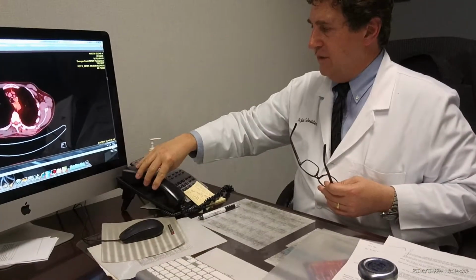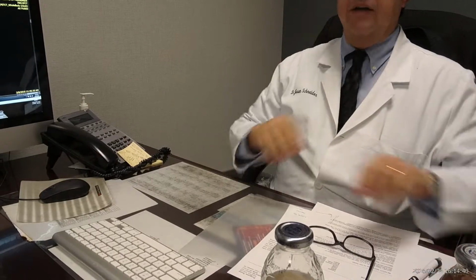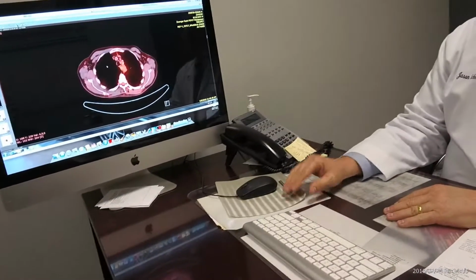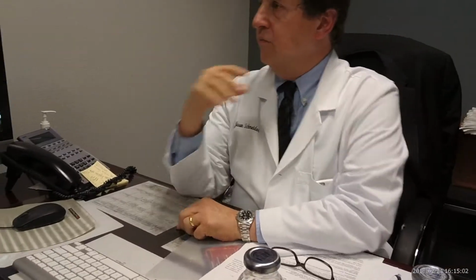Oh, thank you. If I may, after the information that we saw with you before, as you know, we asked you to have this scan done because the areas of the body can have different things going on. This PET scan, which is a CAT scan along with the functionality scan, gives us a clinical indication whether there is potential for something unfortunate to be infection, inflammation, or possibly a cancer. CAT scan or PET scans will light up in any of these three places, but what you have to do when you see these is correlate the structure that's lighting up.